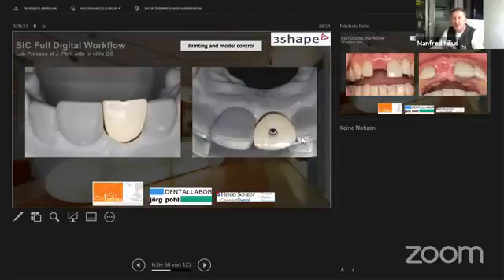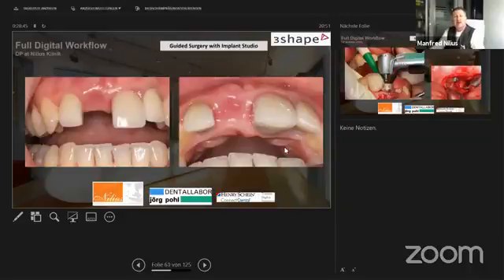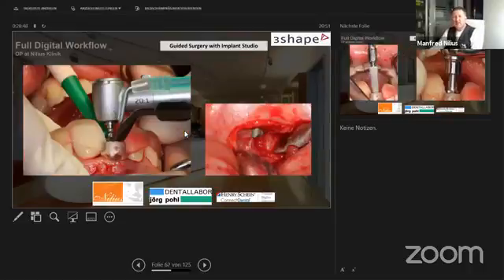The only thing you have to do is to make the operation and to hope that the crown, or the implant, is in the right position in all 3 dimensions, in the X, Y, and Z dimension. So, the situation intraorally, implantation. Here you can see the resected root. When I have an infection of a root canal filling in the apical part, I have to remove this foreign body, and when you do so, you can see the apex of my drilling, and this is the defect with the apical lesion in the bone.